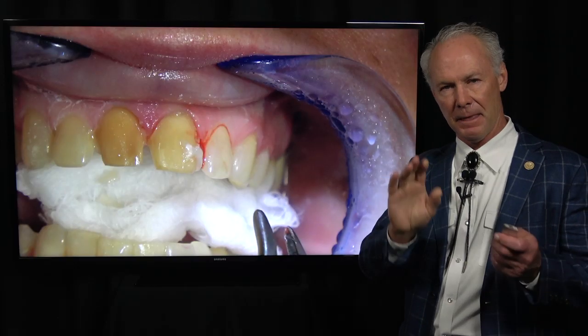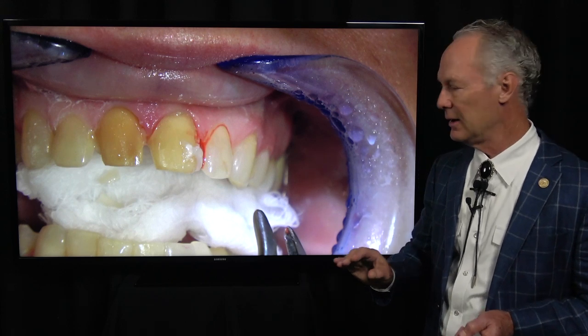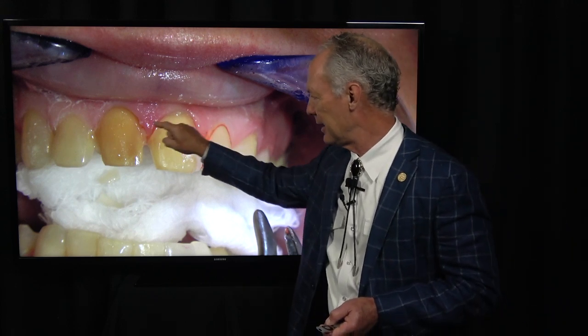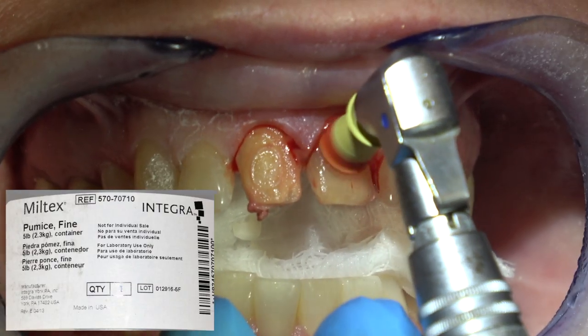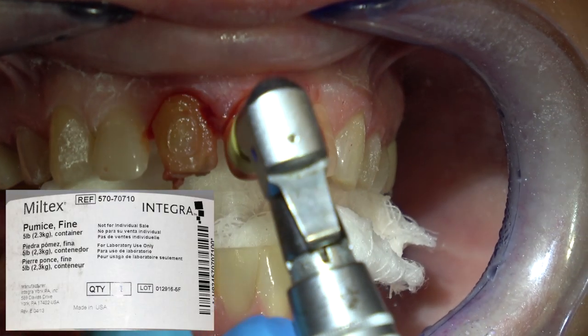It's a question mark whether to use etch or not. The learning point here is: if I did that again, I'd probably just use a tiny little dot. Even though that wasn't a big dot, it was enough that this is hard to get off. I probably didn't need any etch at all.